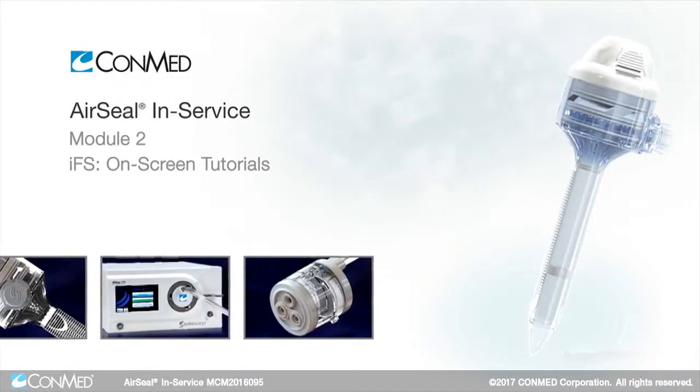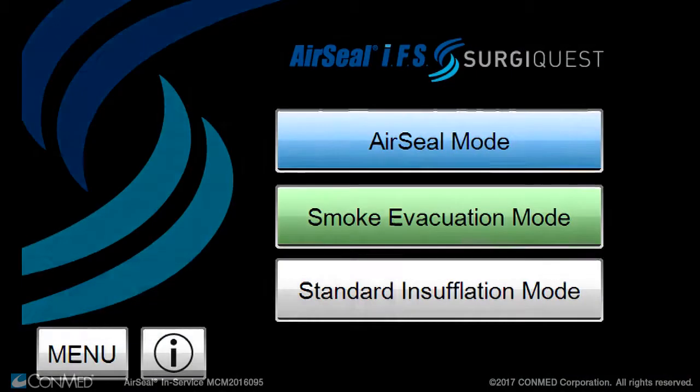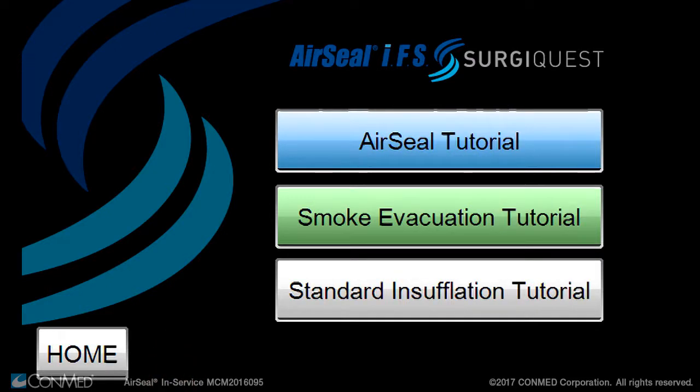The iFS touchscreen can display a convenient tutorial on the AirSeal system, its functions, and settings. The tutorial is engaged by pressing the information icon on the touchscreen display. All three modes will display with a tutorial suffix.